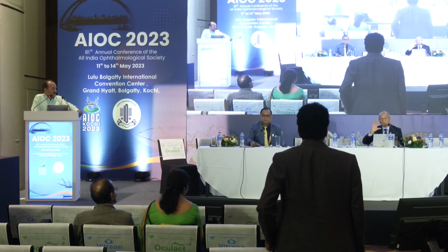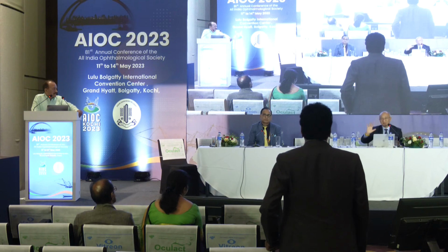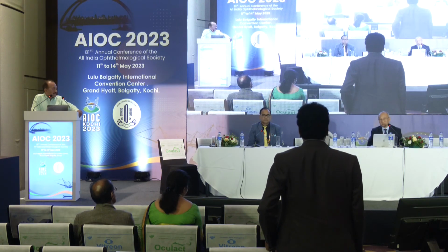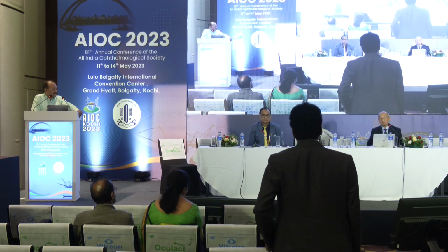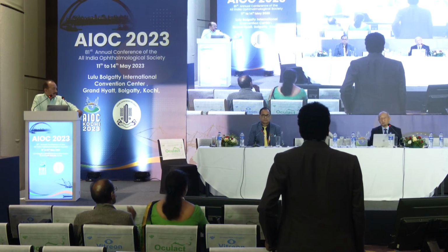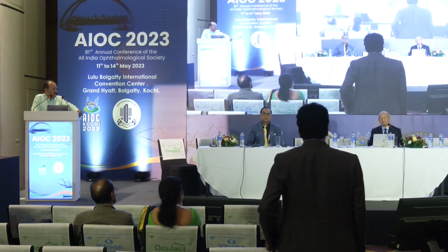True. So we have to diagnose them properly, show them your cornea has 16 scars. See the picture here, the optical zone is hardly 3 millimeters, and your aberration profile is this. So they understand they may not get good vision, and I can't put a trifocal lens in your eye. I'll put a simple monofocal lens, which will give you a better option. So they do understand. We have to break the psychology in these patients. Post LASIK, yes, still if the cornea is good, you can still give them good vision. Post LASIK, post SMILE patients.